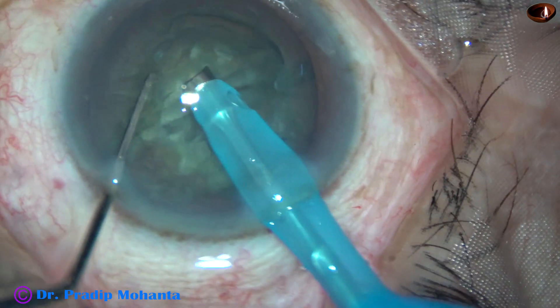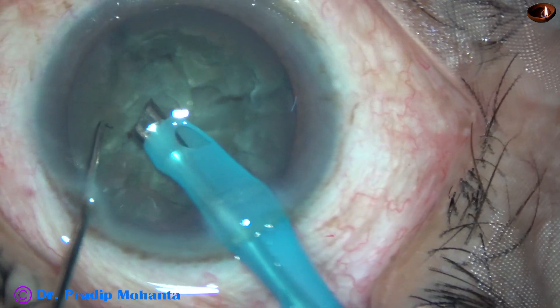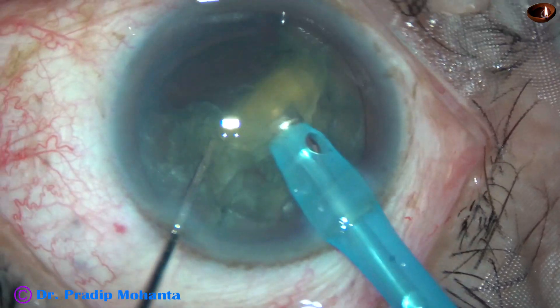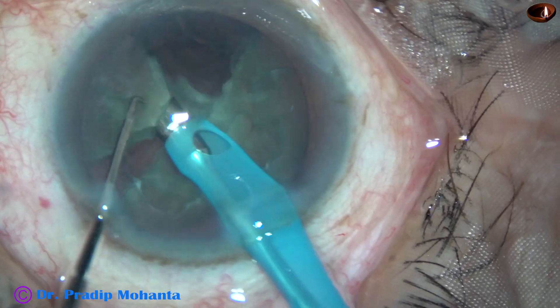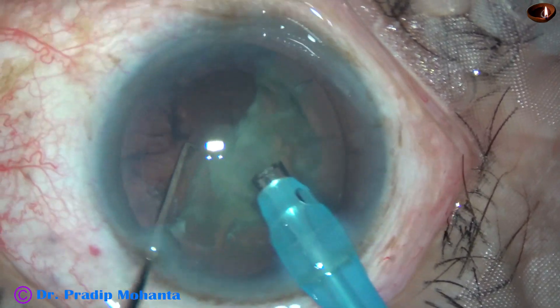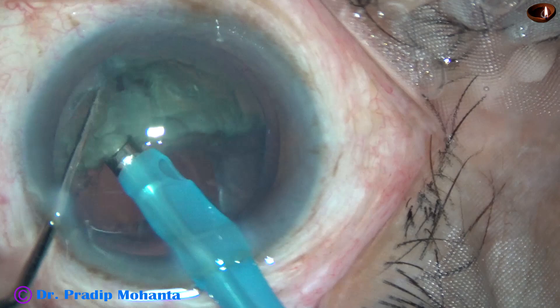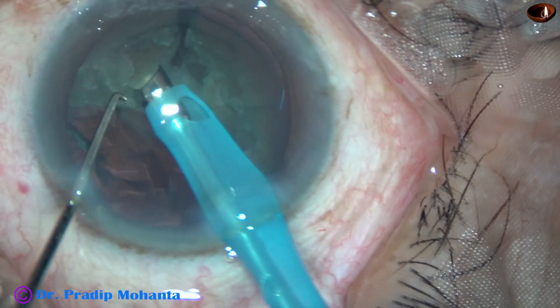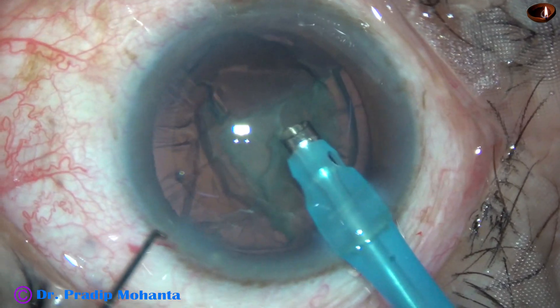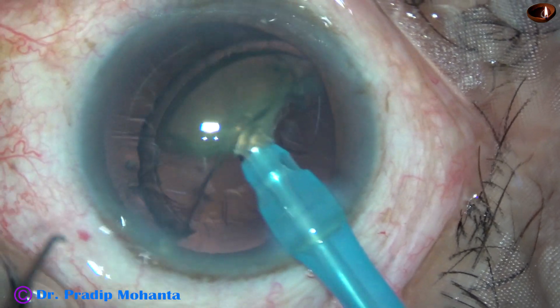The nucleus has been divided into four pieces and now each nuclear fragment is emulsified with ultrasonic energy and it is removed. Ultrasonic power used in this case is 60% — 60% was not required, it was set at 60%. Flow rate is 45 ml per minute and vacuum is 450 mm of mercury.